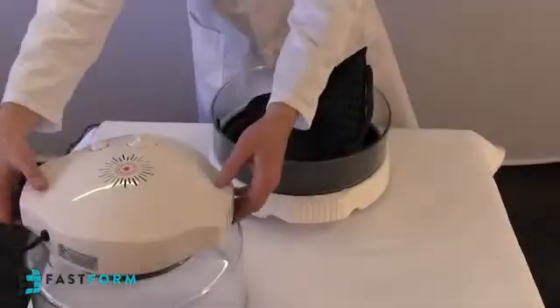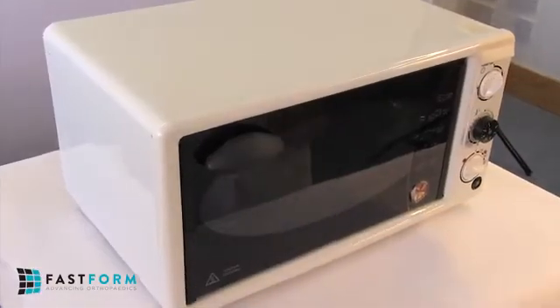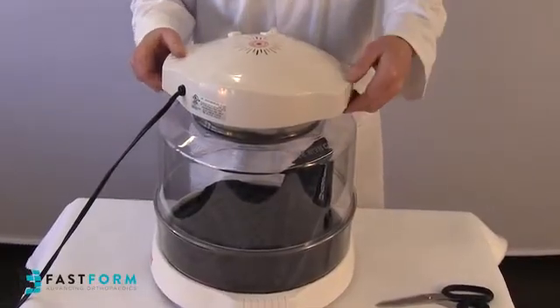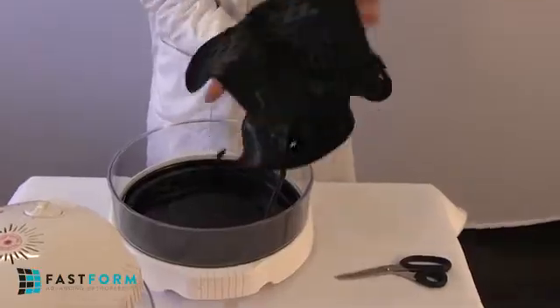The thumb spica is activated by heating in either an infrared oven or conventional oven. Heat the thumb spica until it is soft and malleable all over. Before the thumb spica is removed from the oven, confirm that the spica and thumb hole bridge are malleable. If not, continue to heat in 1-minute increments until soft and pliable.